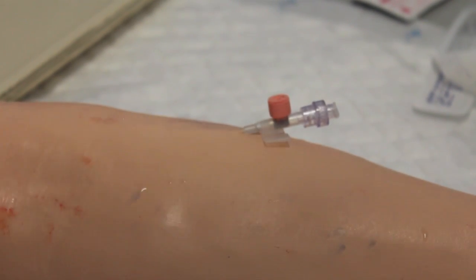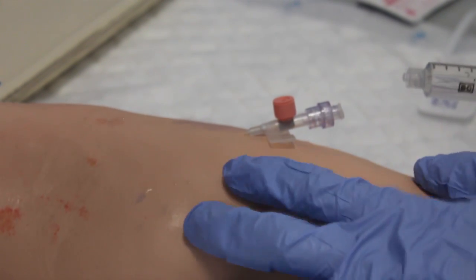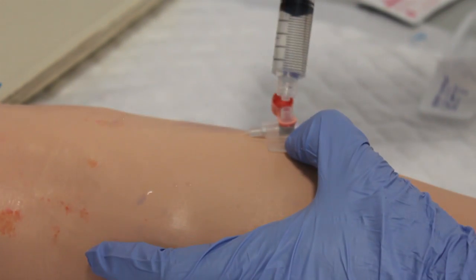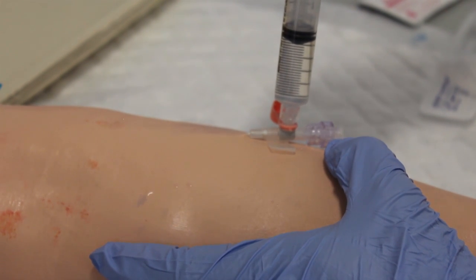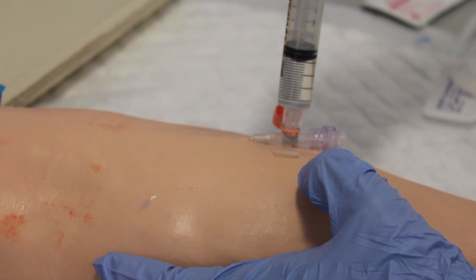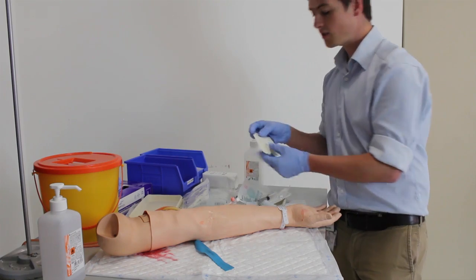Once that's neatly attached, release your finger. Before you fix the cannula down, it's important to check the cannula is patent. Take your saline flush and attach it to the top valve, then warn the patient they'll feel a cool sensation in their arm, and slowly inject the fluid. If it's patent — as this is — you'll see there's no swelling of the tissue in the local area and it goes in with little resistance. Then remove the flush and reseal the valve.